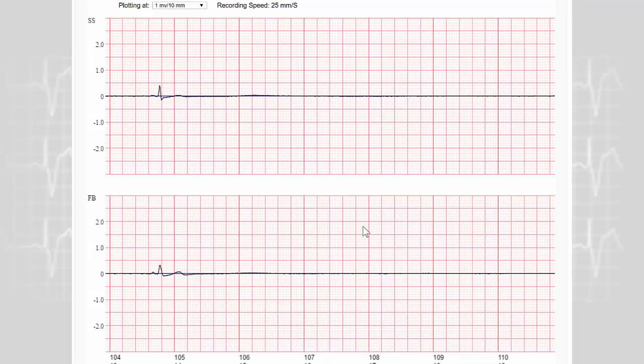The LifeVest does not provide backup anti-bradycardia pacing, but if the LifeVest detects an episode of asystole, it gives an announcement to call the ambulance so that bystanders can respond.